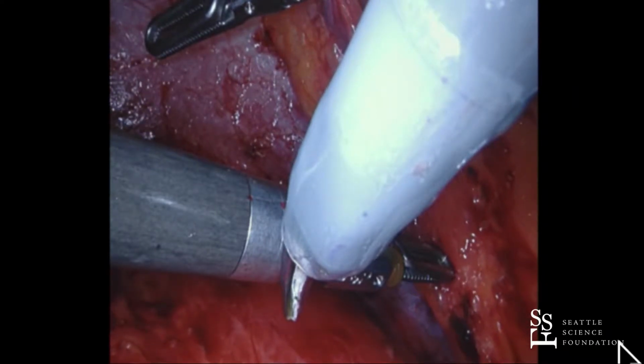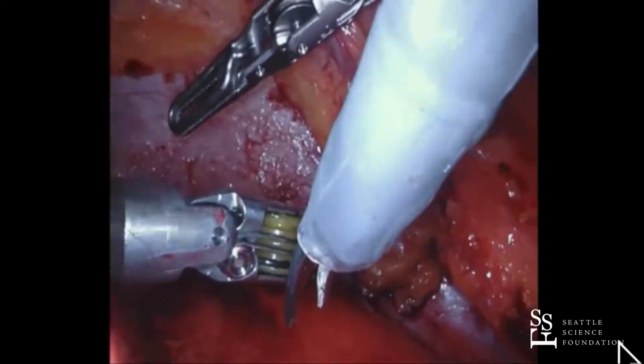All right, so let's clean the scope. We got a dot on the right eye, please. Actually, we don't. That's fat.